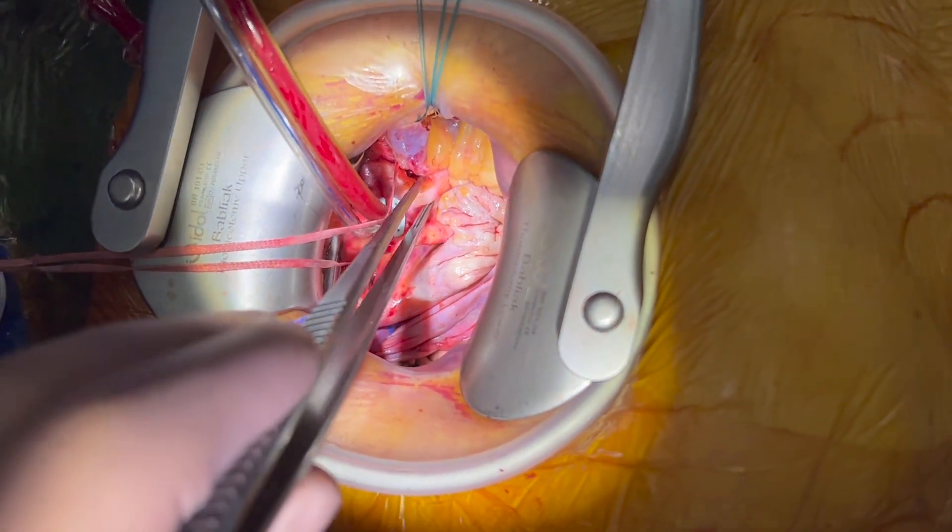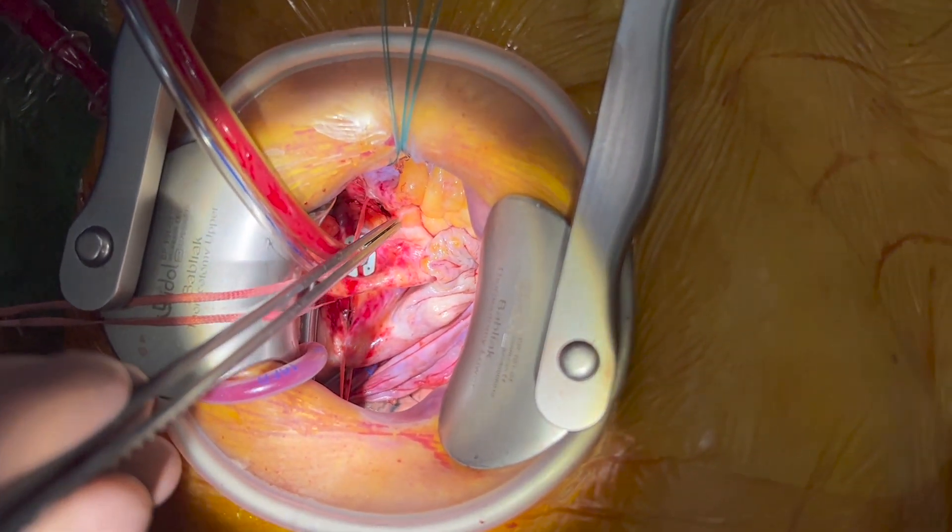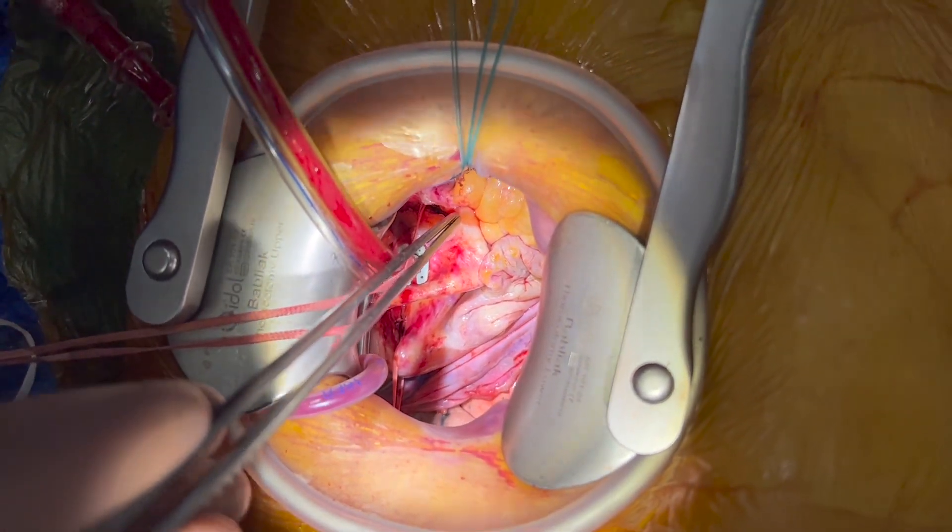One important thing is that the tip of the femoral venous cannula should be stiff to prevent kinking when pulling.